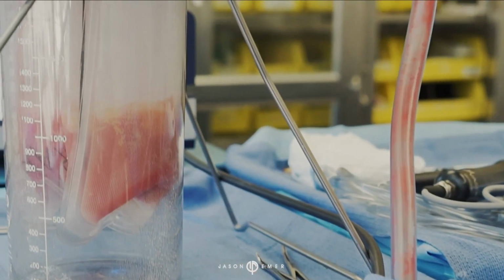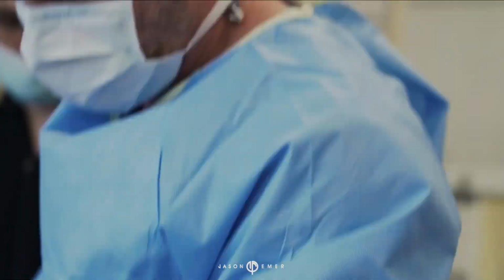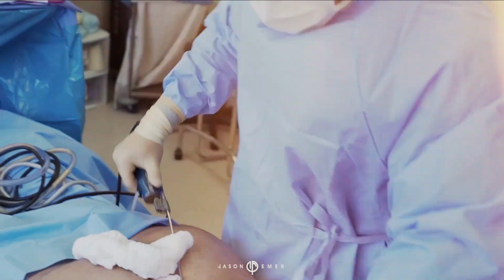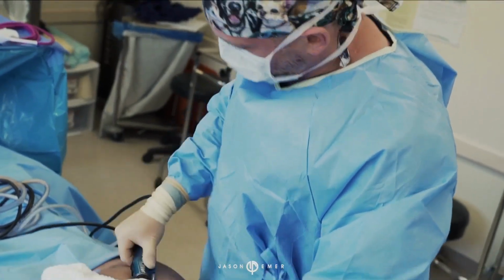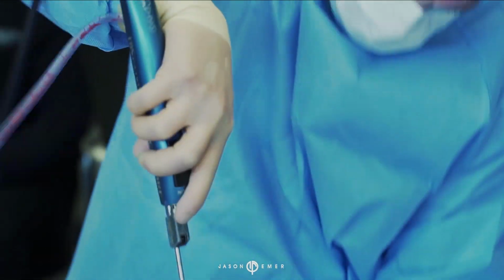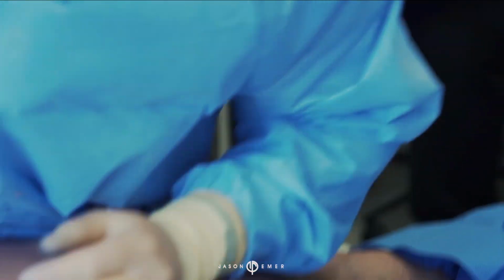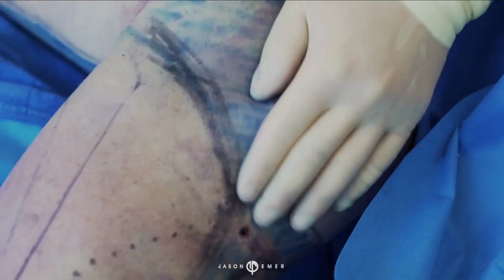So now we're removing the fat that we vasored, and it comes out much easier. Someone especially so lean, we don't want to leave them with any indentation, so we're using a power assisted device to go in there and remove some fat. So let's see how much we get out. So now we're sculpting out the shoulder. You guys can see we're going to create a natural indentation, so it's going to look really athletic.